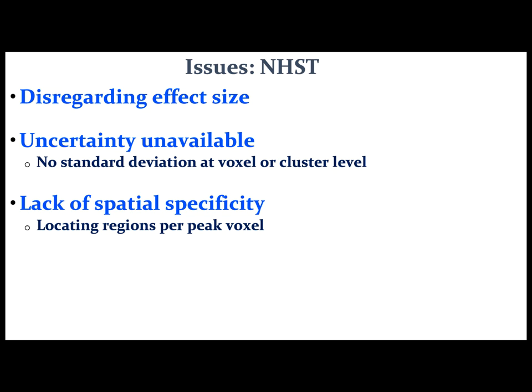So the next issue is what I call a lack of spatial specificity. That's because when you have a cluster that survives, that cluster is purely based on statistical evidence. Based on, for example, the t statistic, you have that cluster colored with some color spectrum.